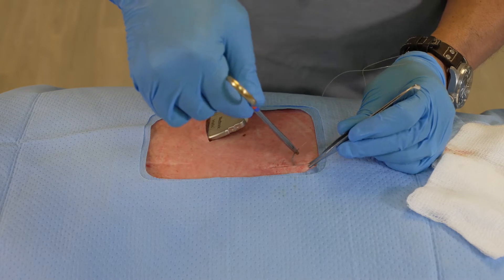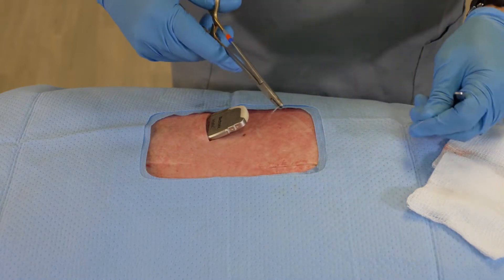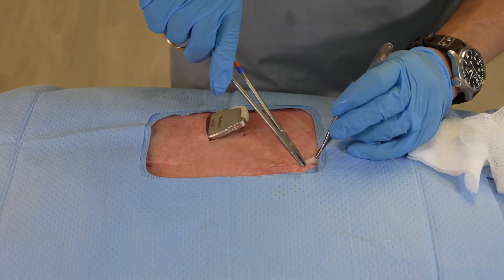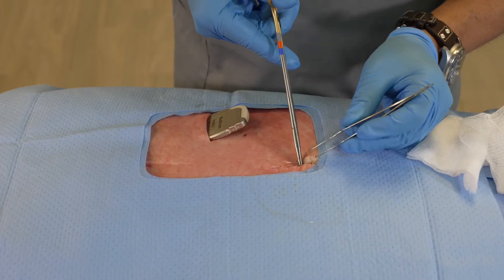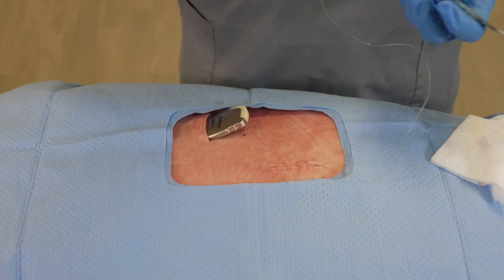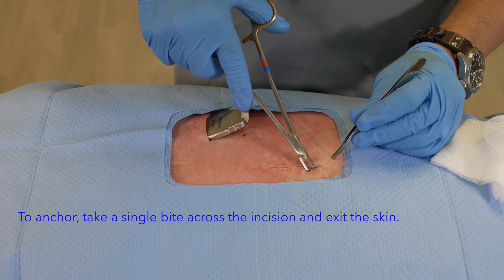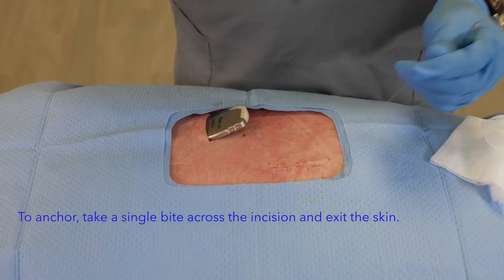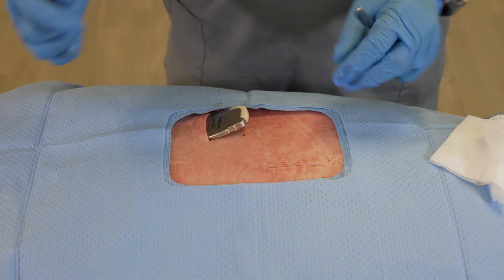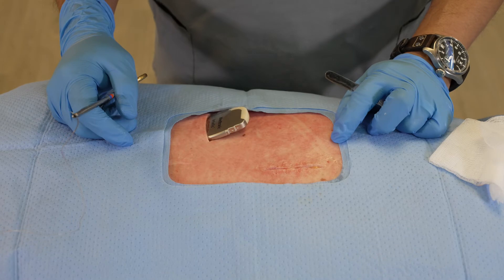In a matter of a couple of minutes I have my first layer almost completed. One very important fact to remember is that even after I have completed my run, I'm still not under pressure to create a knot — I can actually come through the tissue and cut the suture, and by doing so I have a very secure wound with significant tension applied that is completely sealed off.